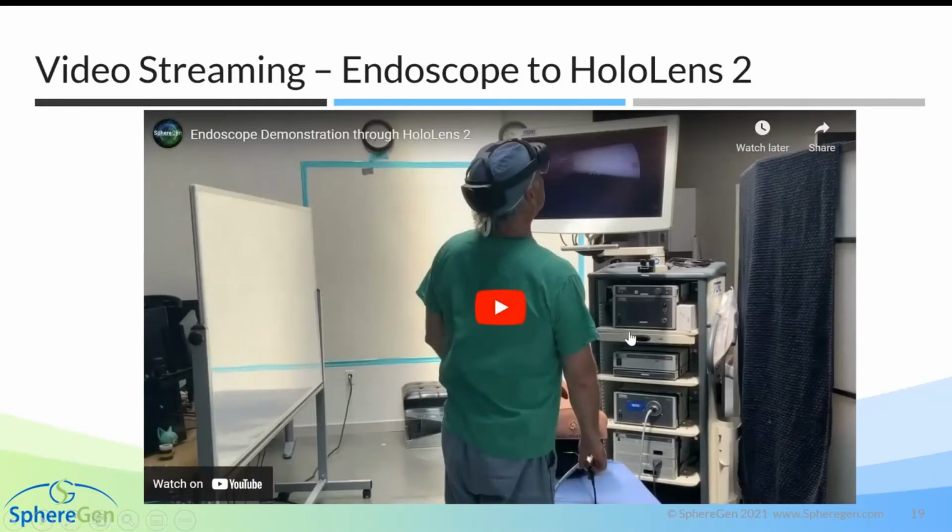So on to the laparoscopy. Dr. Pearlstone, I'll let you speak to this. This is actually you in the video, so please keep in mind, Dr. Pearlstone is a surgeon by trade and now CEO. We don't have any paid actors on our staff, but this will definitely get the message across. So I turn it over to you, Dr. Pearlstone.